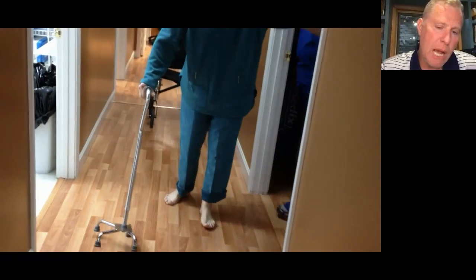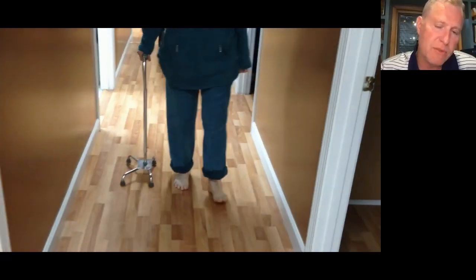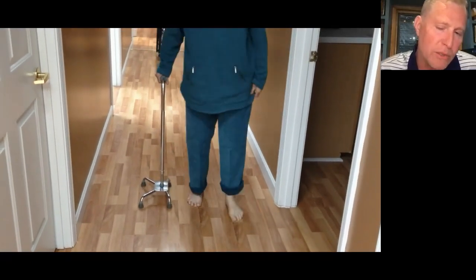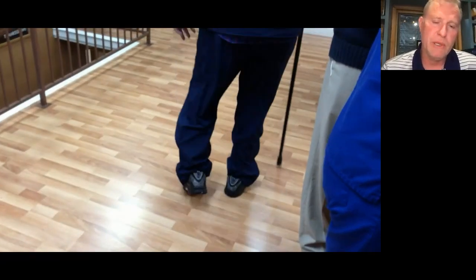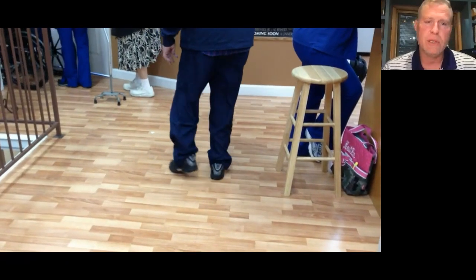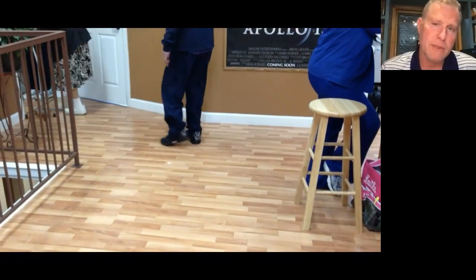the most common characteristics of those at risk, and it's really simple. If someone has to use an assistive device, they are at risk. If someone requires help or assistance, or if they have to hold on to the walls, slowly turn around and walk into your treatment rooms, they're at risk. When a patient is using an assistive device and clearly dragging their feet, and notice, again, the people exiting my office are all using assistive devices. These are all balance patients.